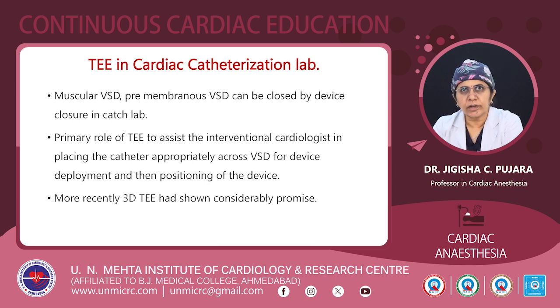Role of TEE in the cardiac catheterization lab. Muscular VSD and perimembranous VSD can be closed by device closure in the cath lab. The primary role of the TEE is to assist the interventional cardiologist in placing the catheter appropriately across the VSD, then device deployment and positioning of the device.